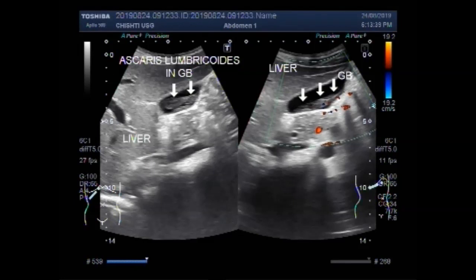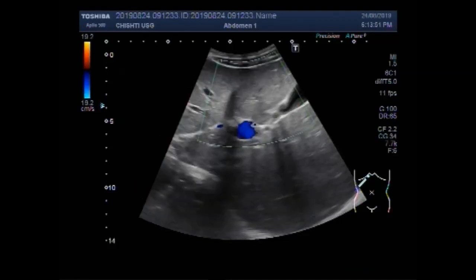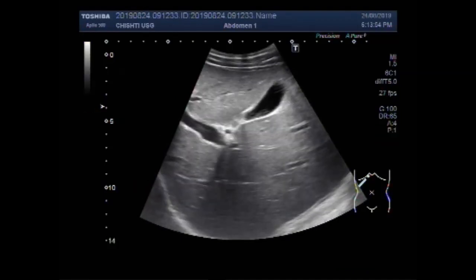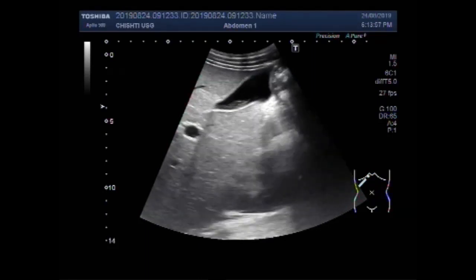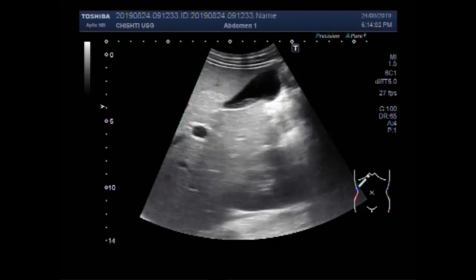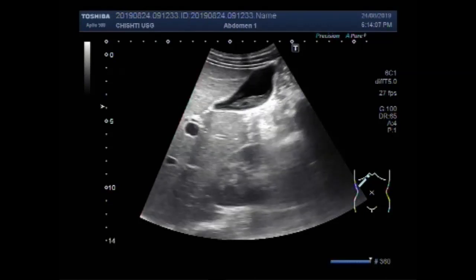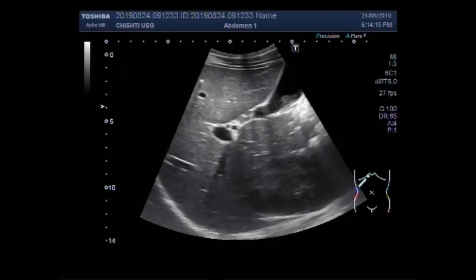This ultrasound video shows Ascaris lumbricoides properties in the gallbladder. You can see the gallbladder and this echogenic material doesn't look like a stone or sludge — it looks like a tubular structure.